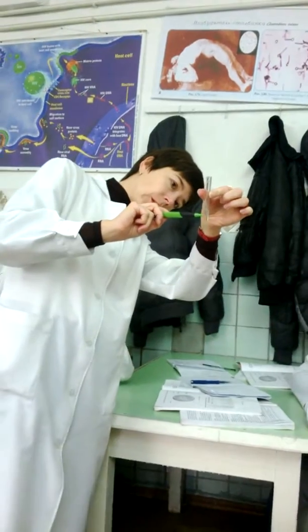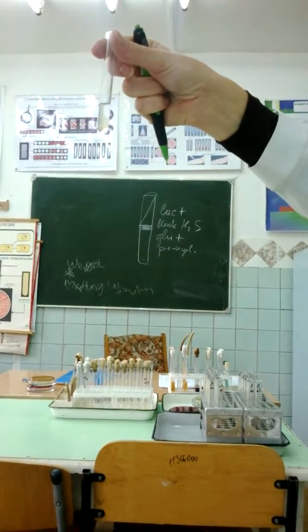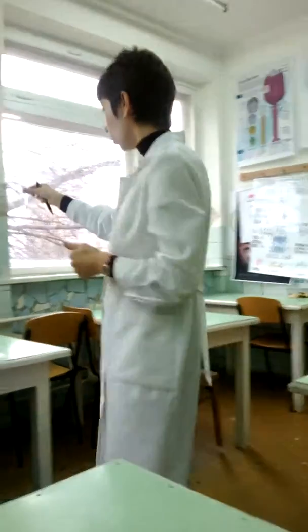Yes? It's a result that in the extract antigens are present. Can you see? If absent, then no precipitation forms.